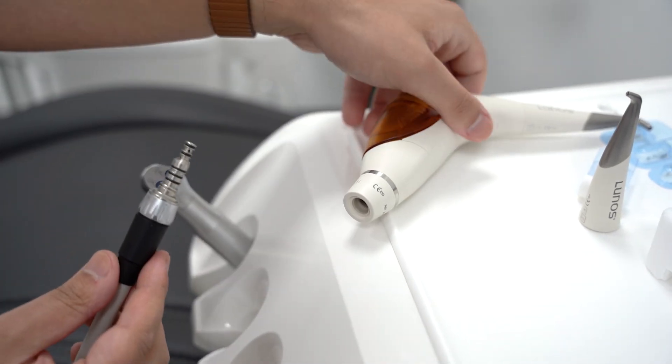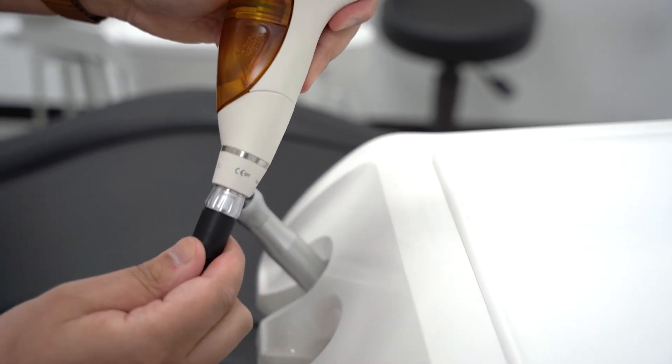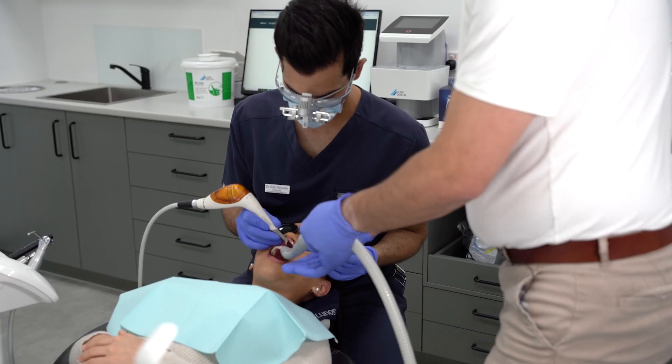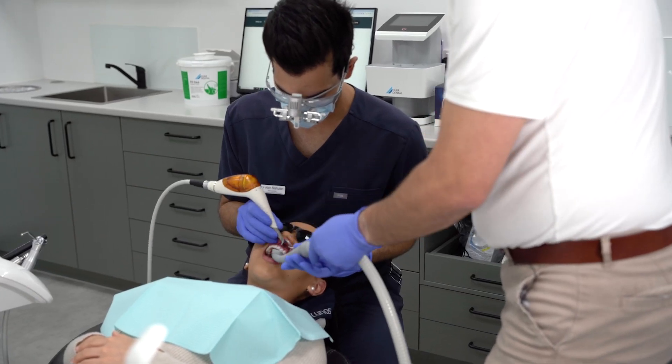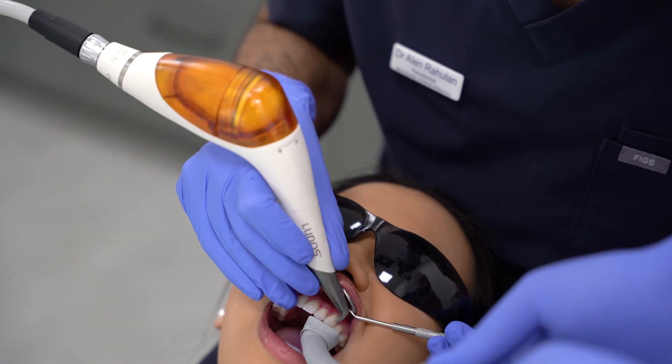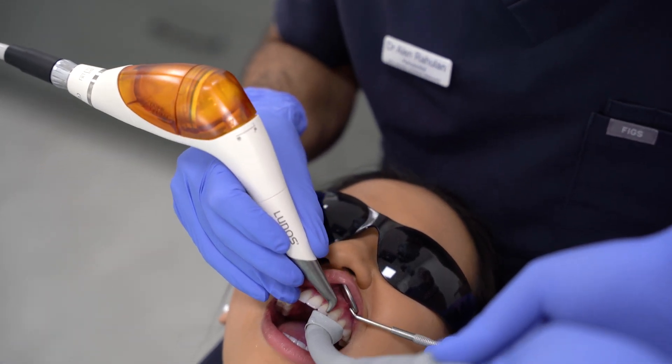The hand pieces are available in the following coupling types. This allows for easy integration into the dental chair by allowing it to connect onto the dental chair using the high-speed line quickly.